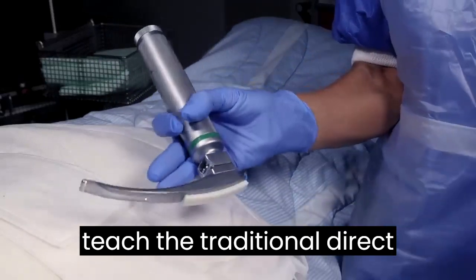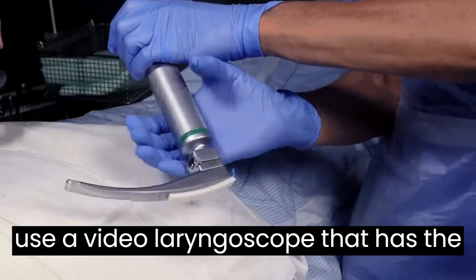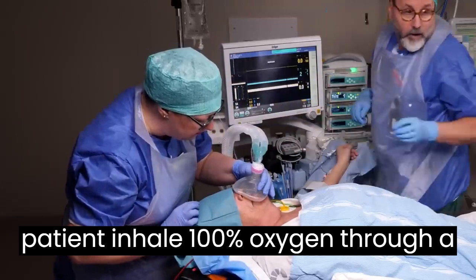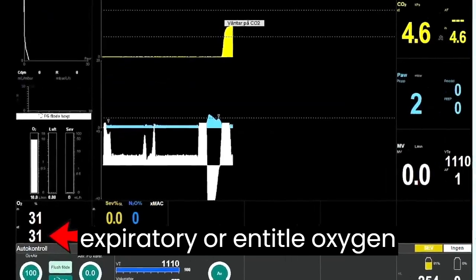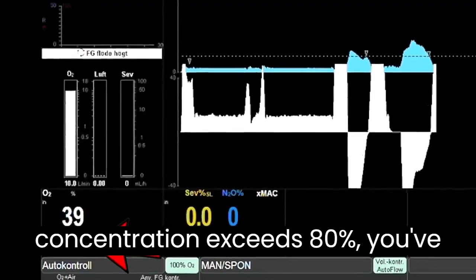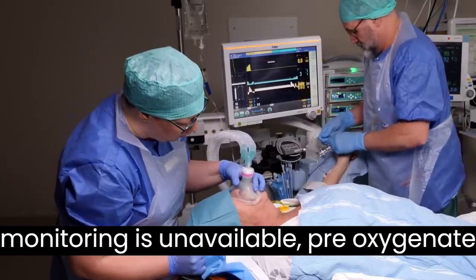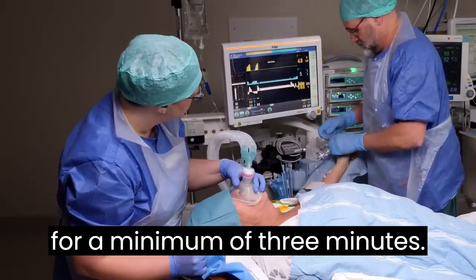We will teach the traditional direct laryngoscopy, but for filming purposes we use a video laryngoscope that has the same shape. Have the patient inhale 100% oxygen through a tight-fitting mask. When the measured expiratory or end-tidal oxygen concentration exceeds 80%, you've loaded up an oxygen reserve in the periphery of the lungs. If this monitoring is unavailable, pre-oxygenate for a minimum of 3 minutes.